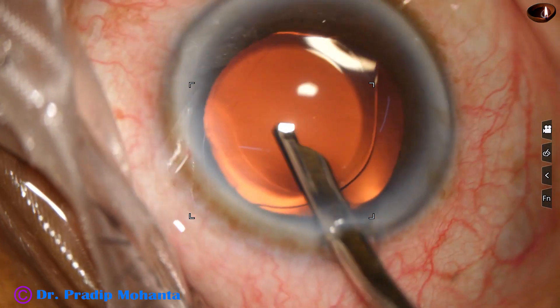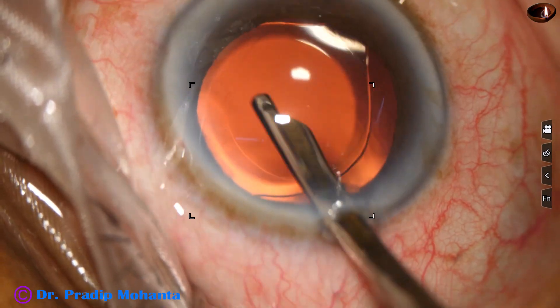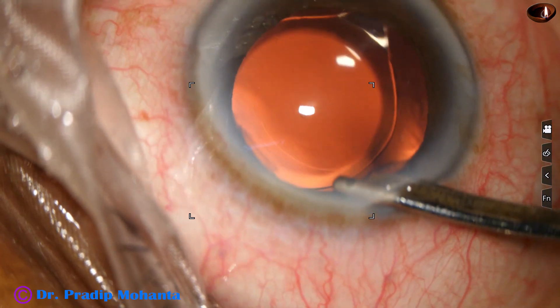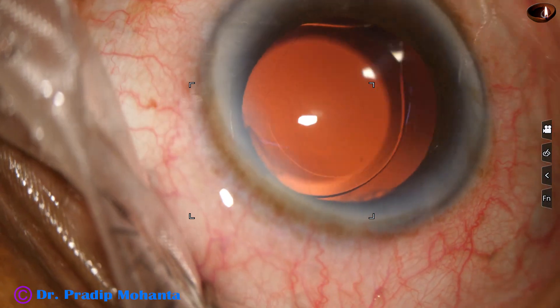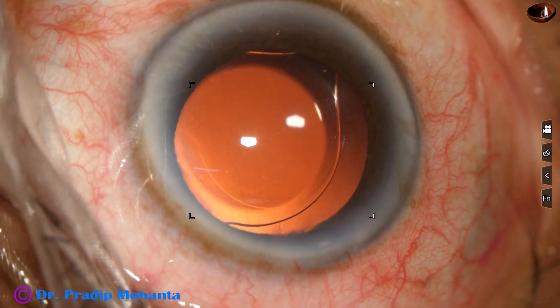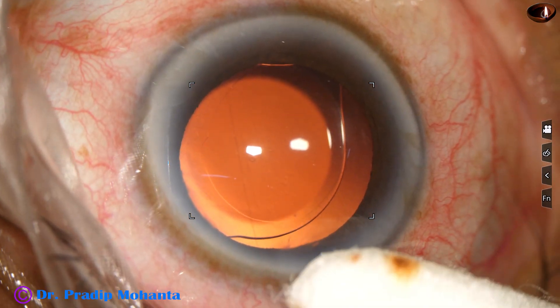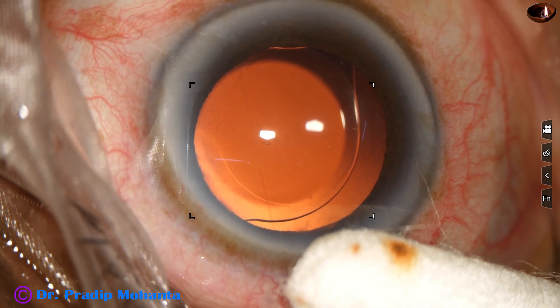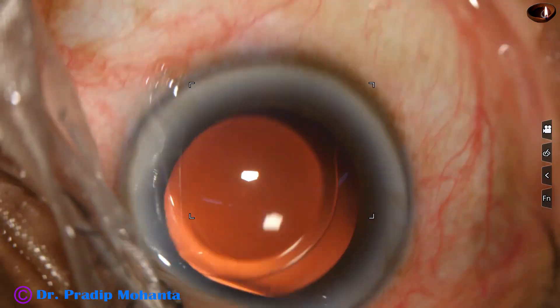All the viscoelastic that sticks to the corneal endothelium is nicely removed. We have to be very gentle at this stage. The anterior chamber is nicely formed. Integrity of all the wounds is checked with a cotton-tipped applicator. A few drops of moxifloxacin are applied over the ocular surface and the case is concluded.